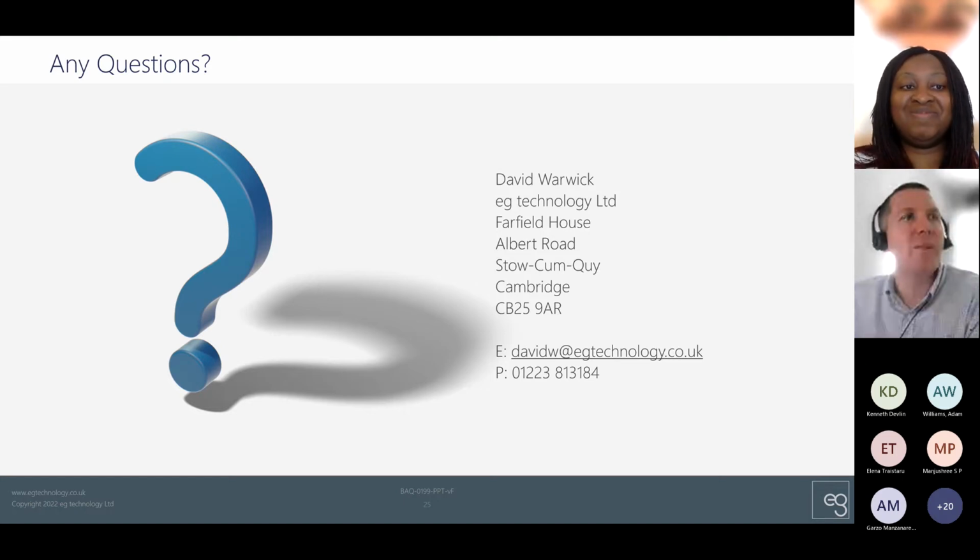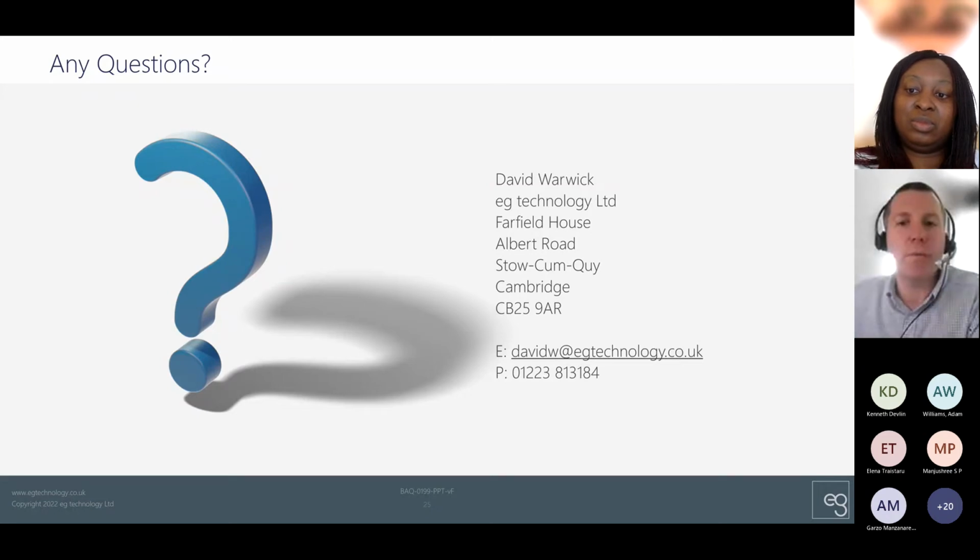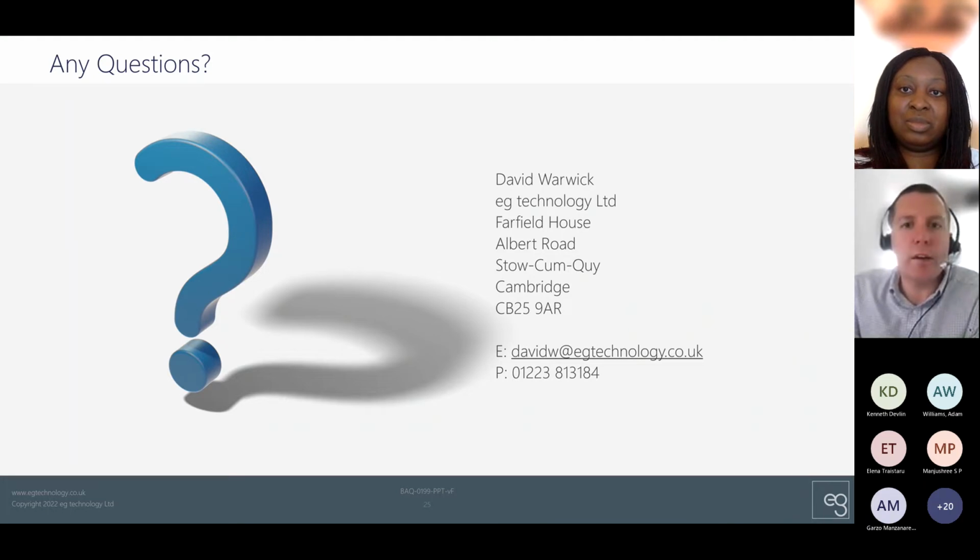I want to give a flippant answer and say a lot. On the face of it, that obviously sounds like quite a high category of device. You'd be surprised though, actually. This is where applying the rules has a significant impact. If the surgery is on the central nervous or central circulatory system, then you are going to be class 3, the highest that you could possibly be. If you're on other parts of general anatomy, then you're most likely going to be a class 2B device, on the face of the very brief description that we've got there.